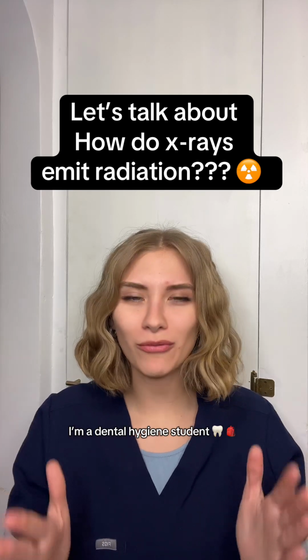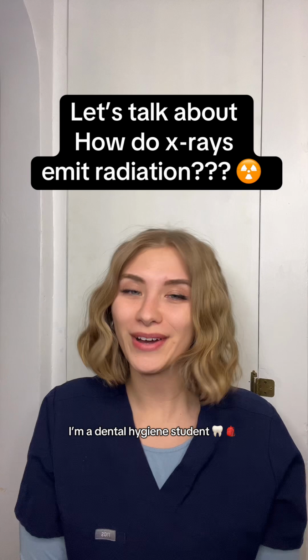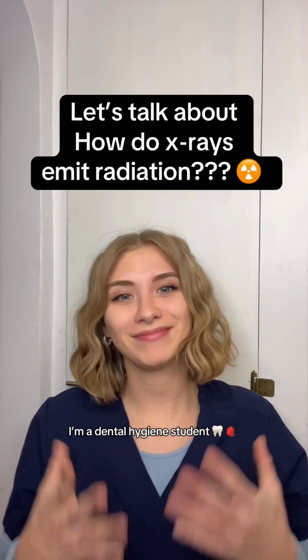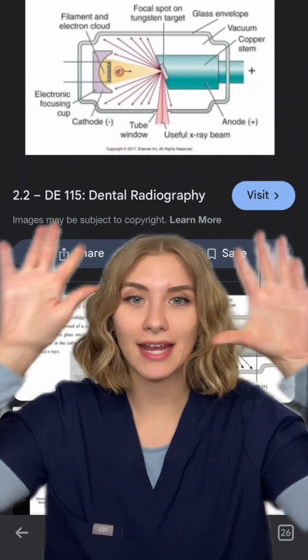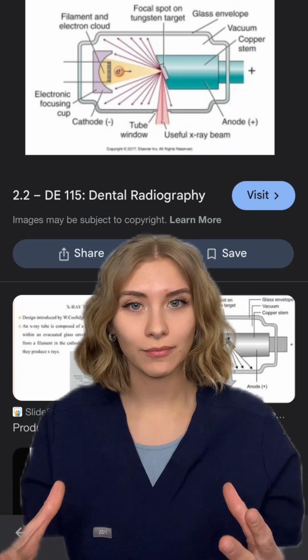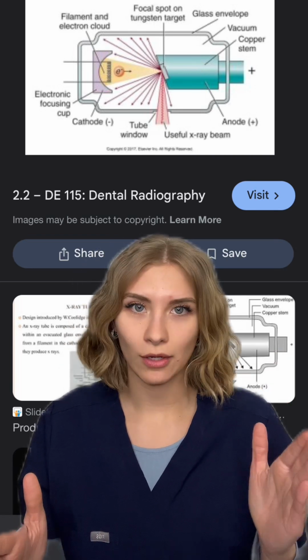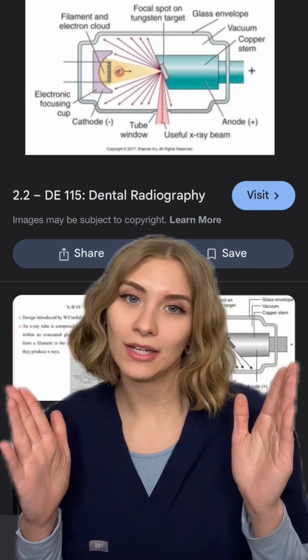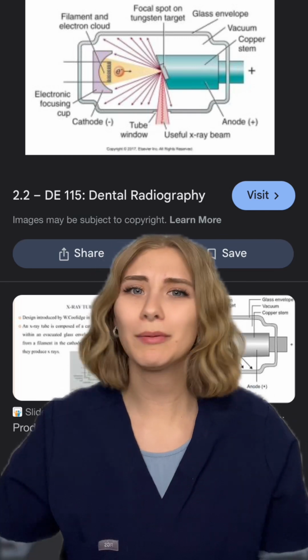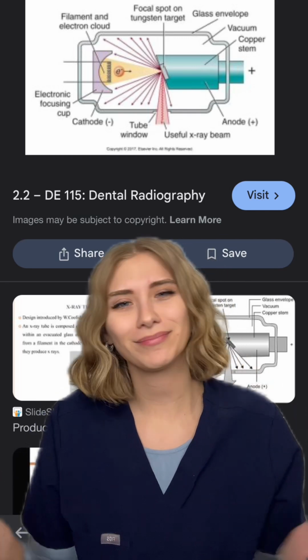X-rays emit radiation? Well, I'm a dental hygiene student. Let's talk about it. This whole thing is the inside of a glass tube head in an X-ray. Firstly, you have a cathode and you have an anode. Cathodes are negative and anodes are positive. A lot of people think about cat scratches are negative.